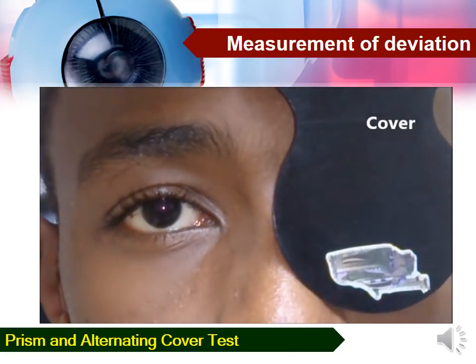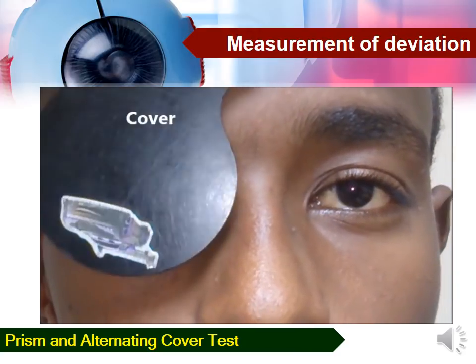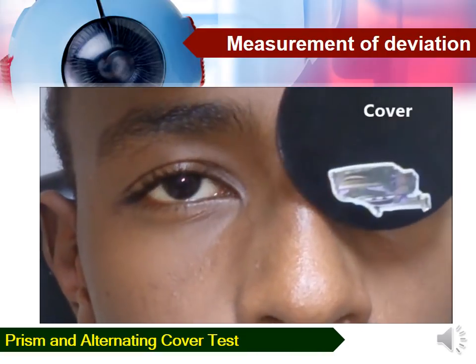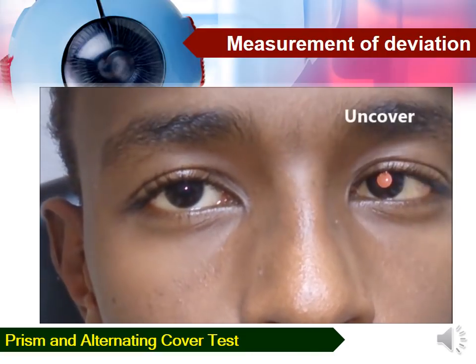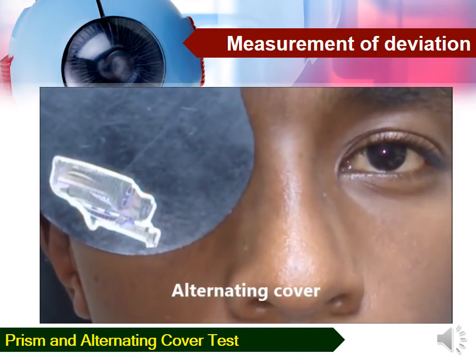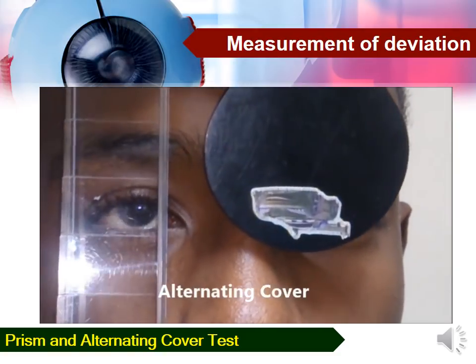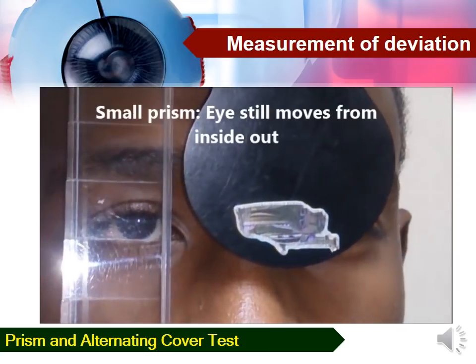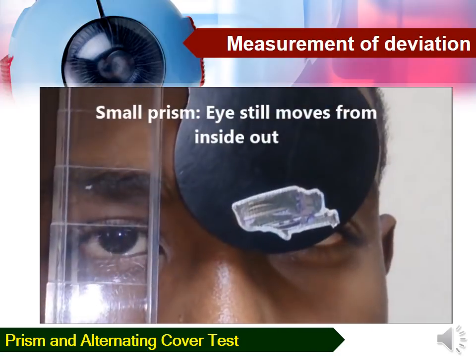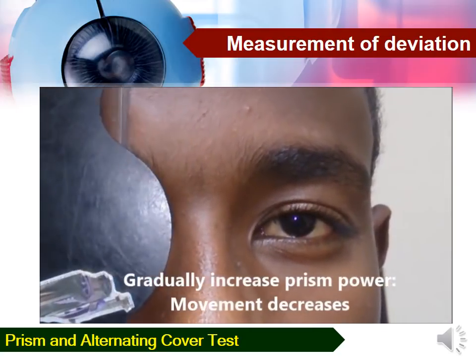This is a patient with esotropia. The eye moves from in to out on cover test. Now we have to place a prism base out to shift the image inward toward the deviation. We gradually increase the prism power until there is no movement of the eye on cover test.